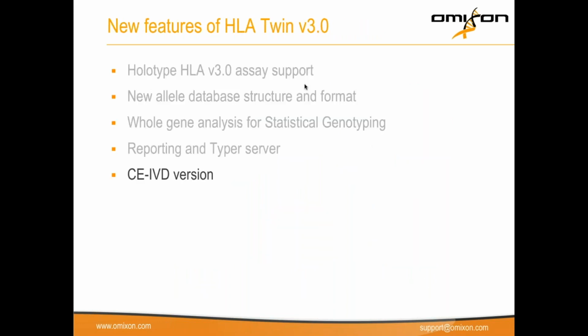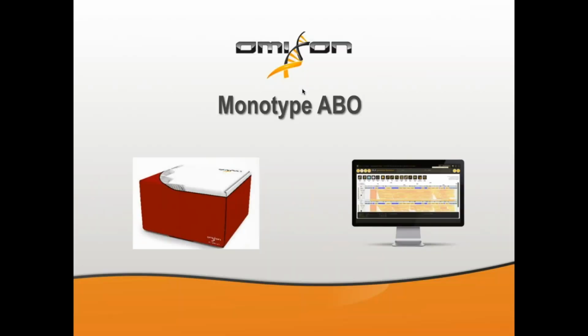Last but not least, the HLA Twin CE that contains all the features mentioned above is currently under testing and will be released for public use very soon. As always, the CE-IVD users will be notified as soon as it becomes available.